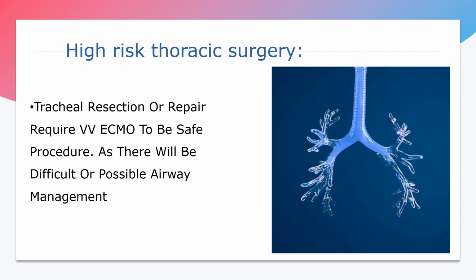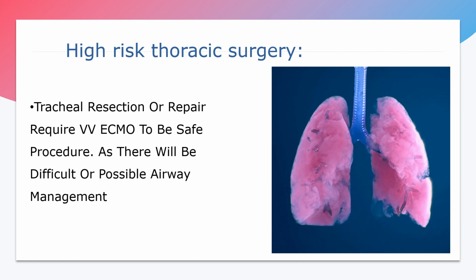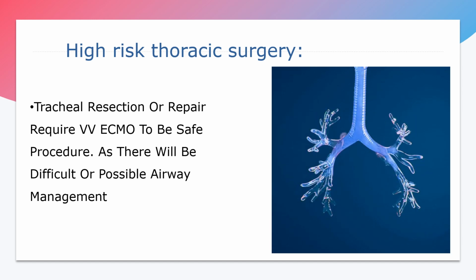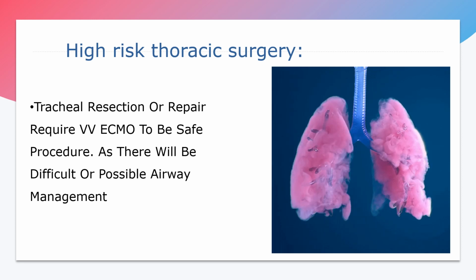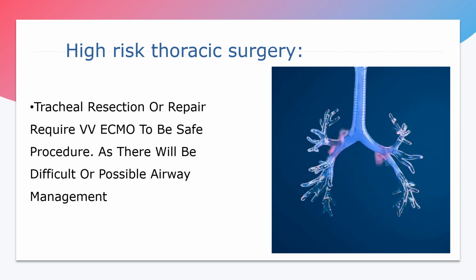Also, ECMO can be used for patients on cardiac surgery who are suffering from cardiogenic shock. They will go for coronary artery bypass, and after bypass and recovery of the heart, the patient can be weaned from VA ECMO immediately in the OR or in the cardiac surgery ICU.